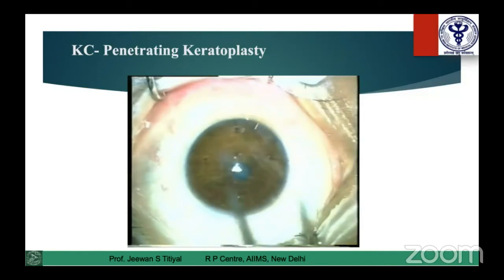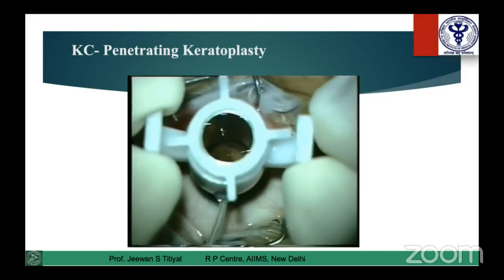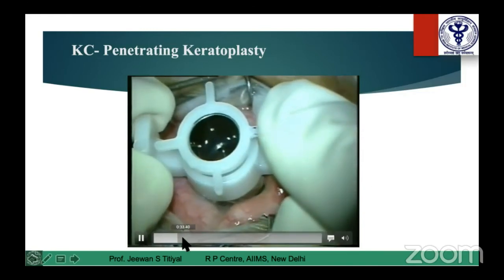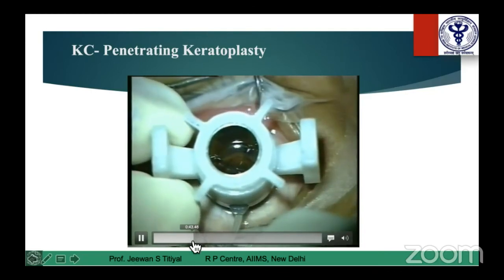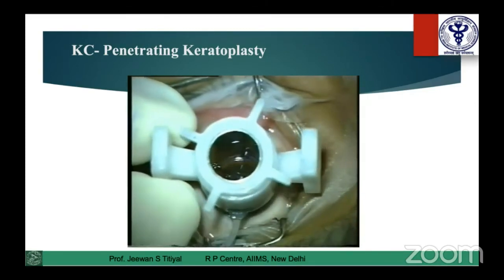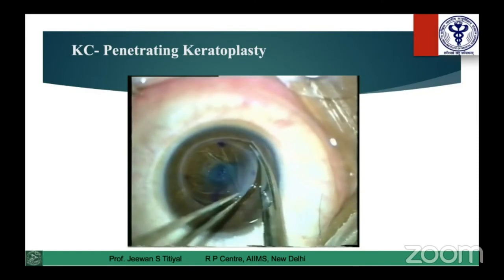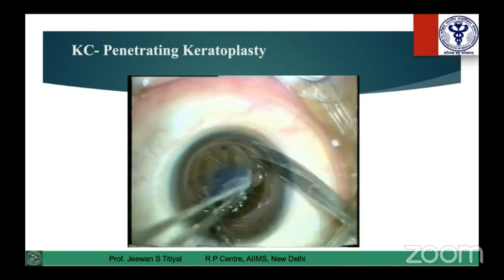General anesthesia will be preferred in such cases because surgery can be longer. If needed, you must put a Flieringa ring also. Suction trephine will give you a better option for such cases. After you achieve suction, go with clockwise rotation till you see beads of aqueous coming up. So I'll rotate clockwise until I see the beads of aqueous coming up. Stop the suction at this time. Then subsequently, you can cut the remaining corneal tissue with corneal scissors. See how effectively you have reached almost 90% of the cornea. Then subsequent release of a little bit of thin stroma is very easy.